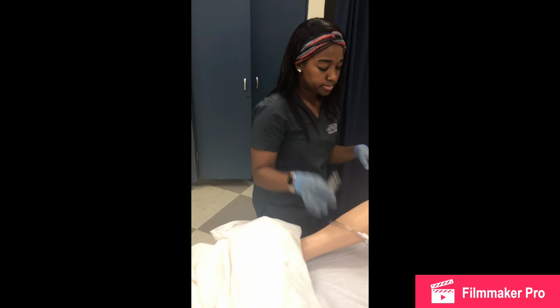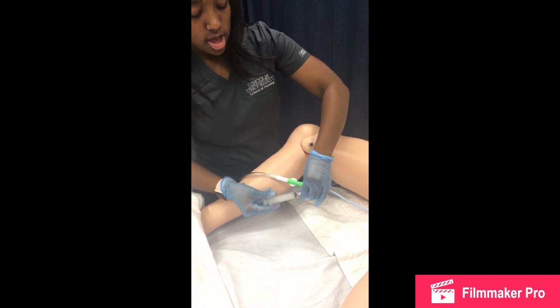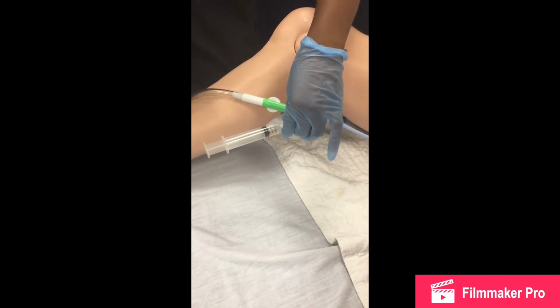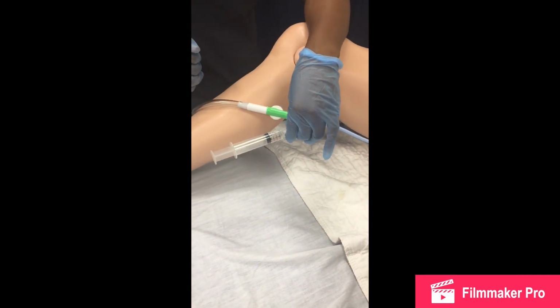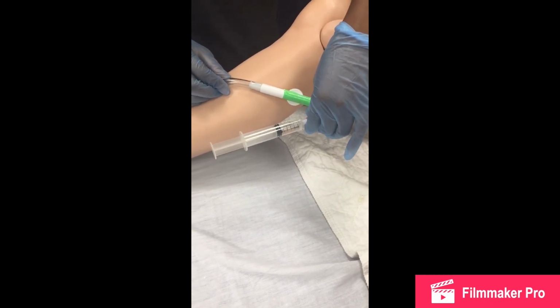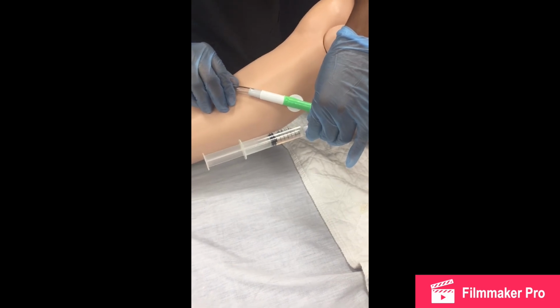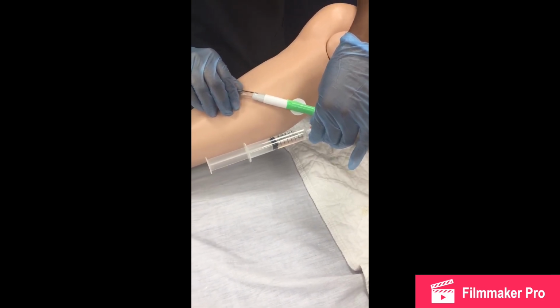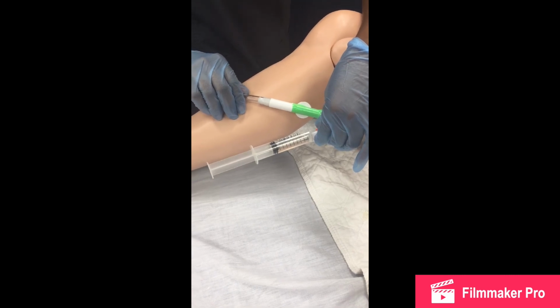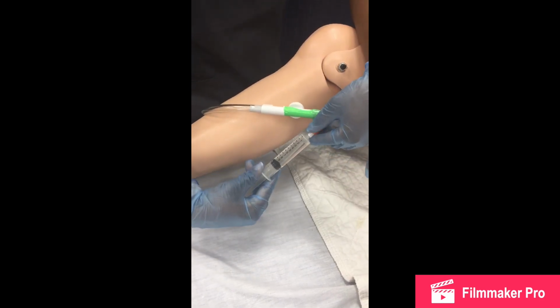And then I have my syringe ready. So I'm going to first take my syringe, place it, and I'm just going to let gravity pull back all of the solution. I noted before that the solution should be 10 milliliters, so that's how much it should return. Okay, great. So it's 10 milliliters.